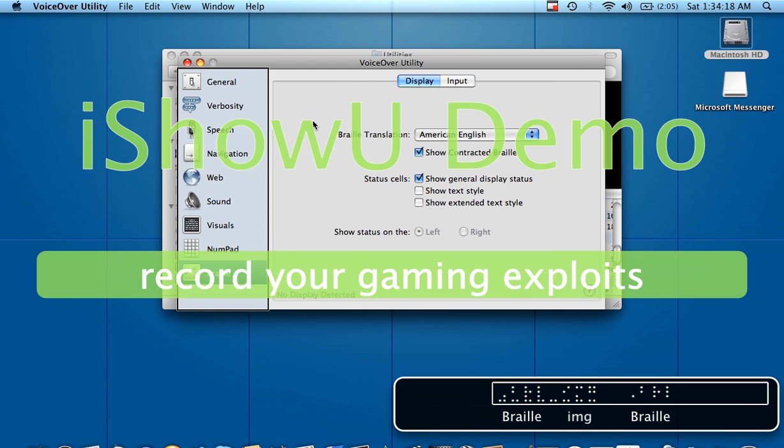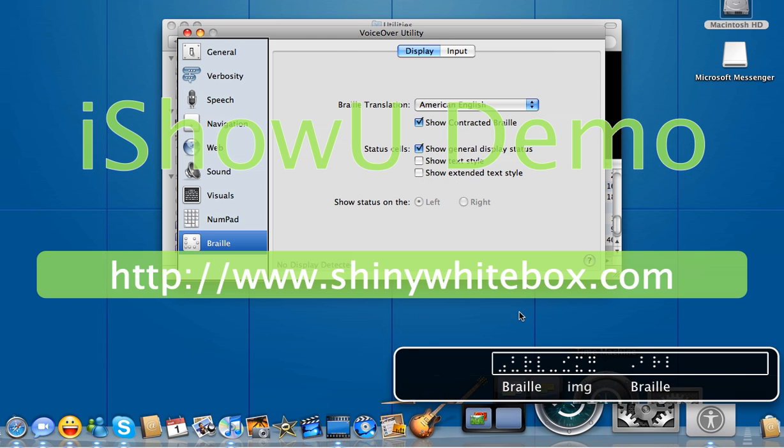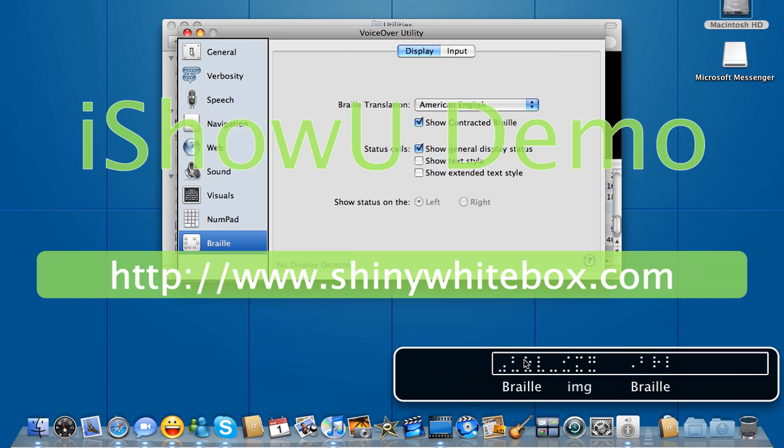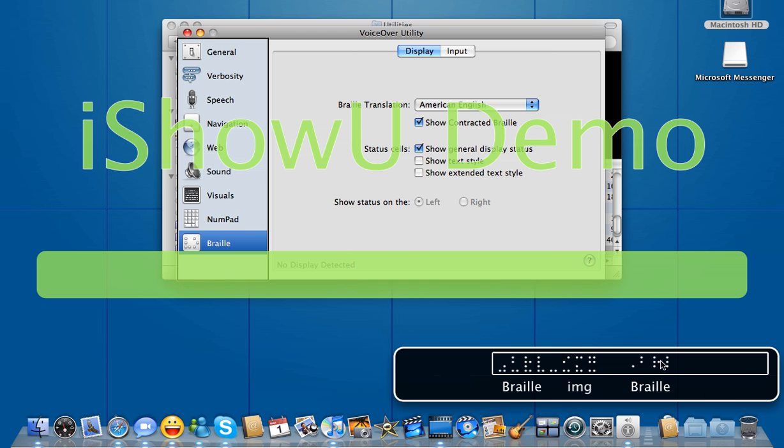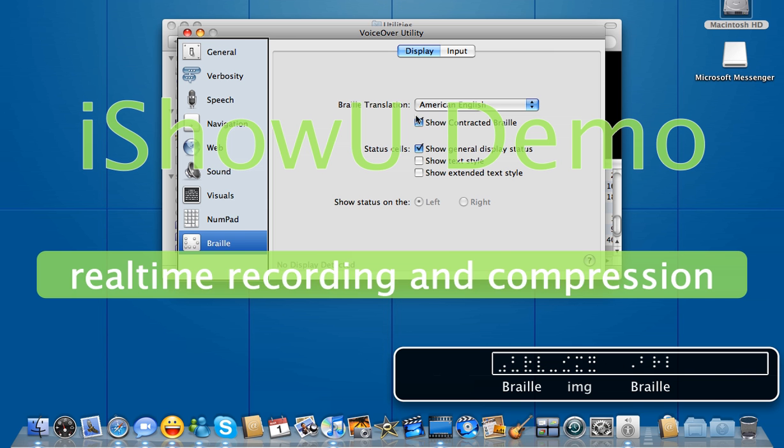This is a virtual braille display, but these settings would apply to this essentially if this were a physical braille display. In other words, there would be pins actually popping up and you would feel these characters with your fingers.